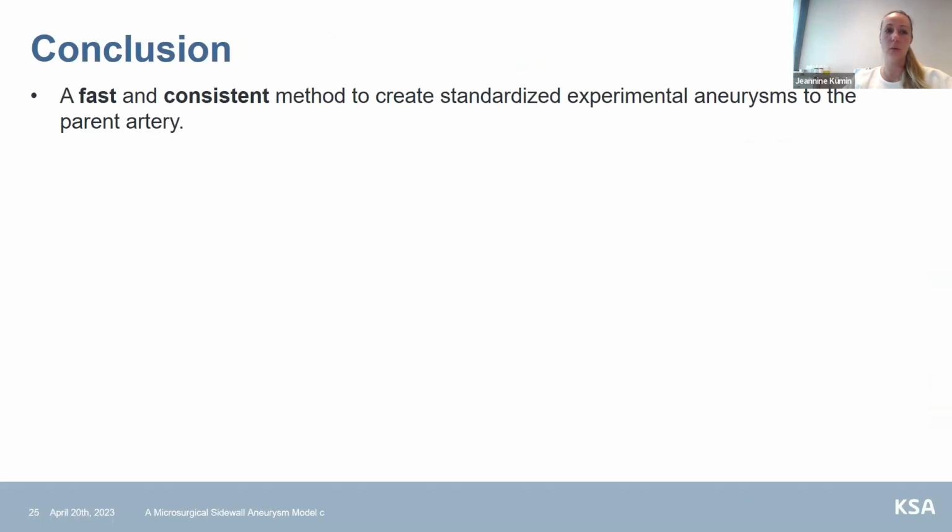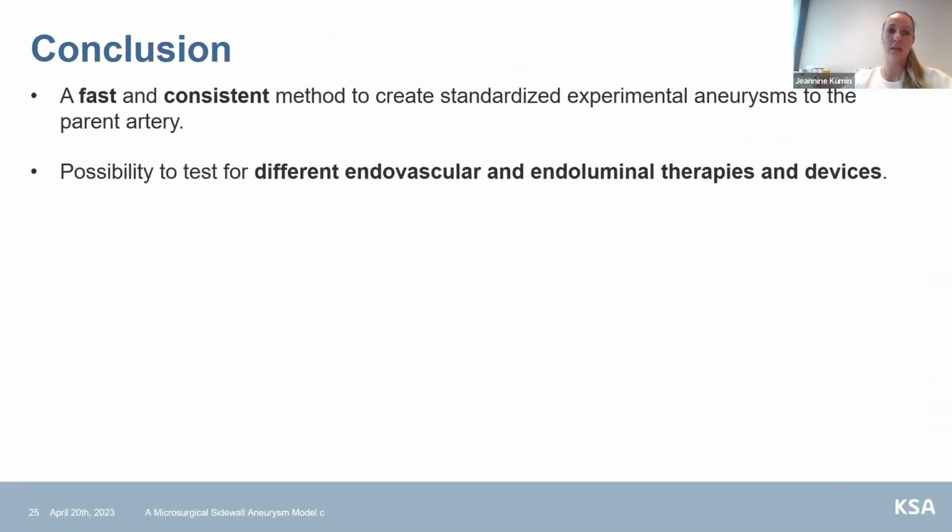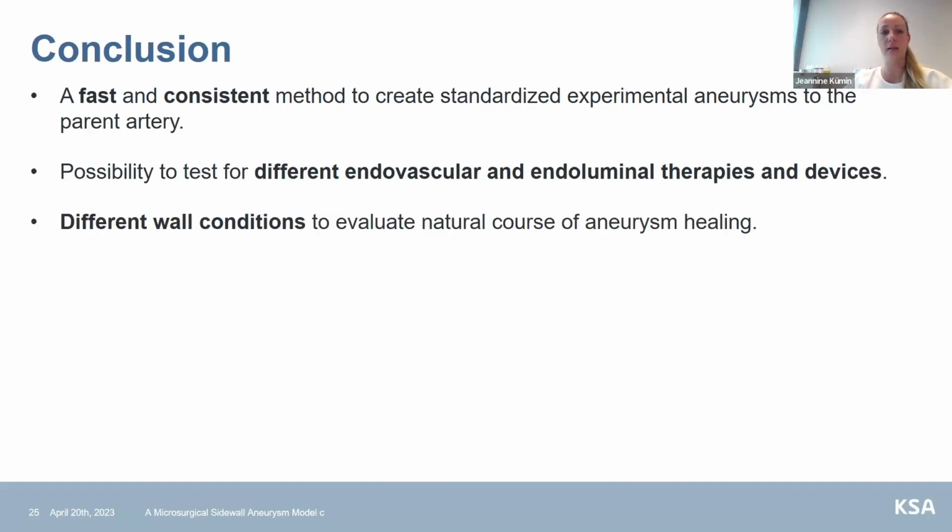To conclude, we have here a very fast and consistent method to create standardized experimental aneurysms to the parent artery, which gives us the possibility to test different endovascular and endoluminal therapies and devices. And we also have the possibility to test aneurysms with different wall conditions to evaluate the natural course of aneurysm healing in rupture-prone decellularized aneurysms compared to relatively vital and healthy aneurysms.